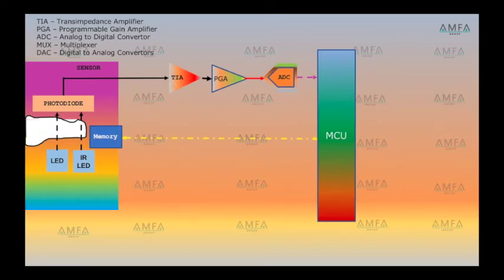So we have a memory where the standard healthy absorption rate is stored. This is based on the empirical data of different healthy persons based on different criteria or age. That statistical value, an empirical table, is kept in the memory to give a reference and to compare with the received data.